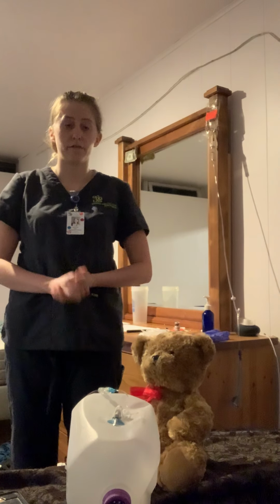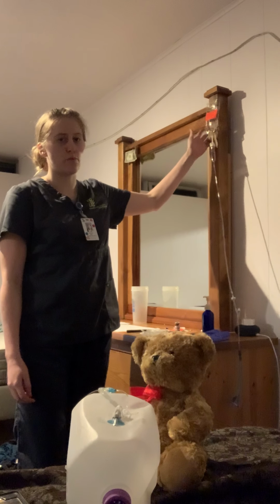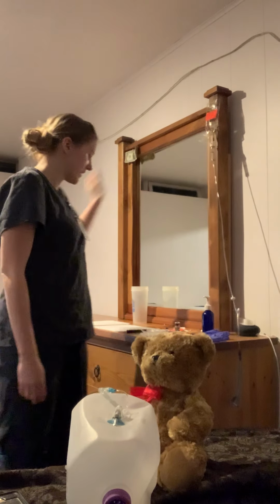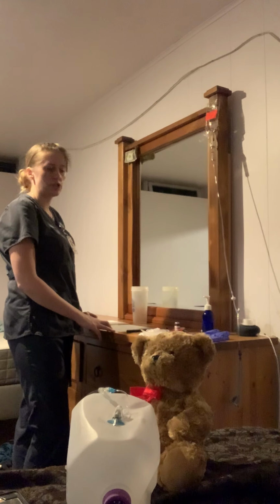Hello, today I'm going to be giving furosemide by IV stat. We have our primary line going here with an incompatible solution. So the first thing I'm going to do is start with my 7 medication checks.